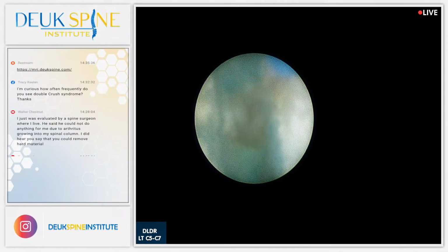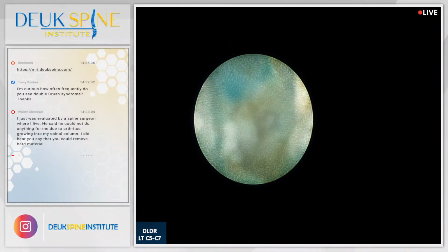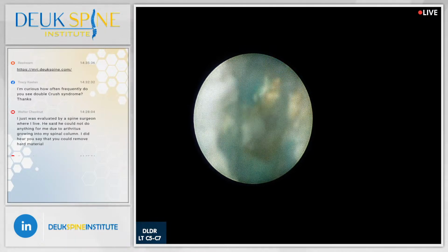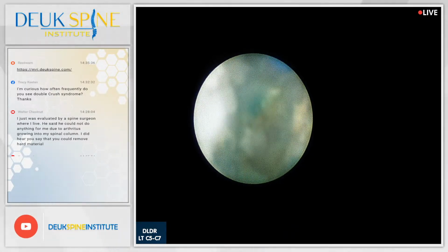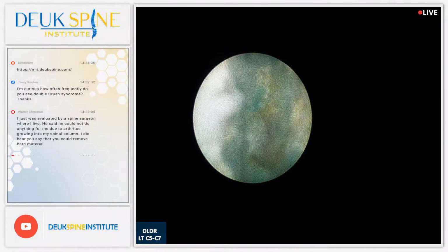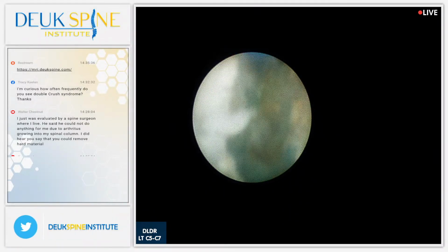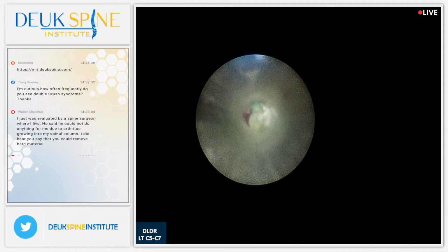These are bone spurs here. This is arthritis. You're looking at arthritis. A lot of this right here is scar tissue. All right, the herniations have come out. They were little ones. They just created a lot of scar tissue in this patient. Now, I don't normally remove too much scar tissue, but I'm not seeing much else right now. We've gotten most of it.